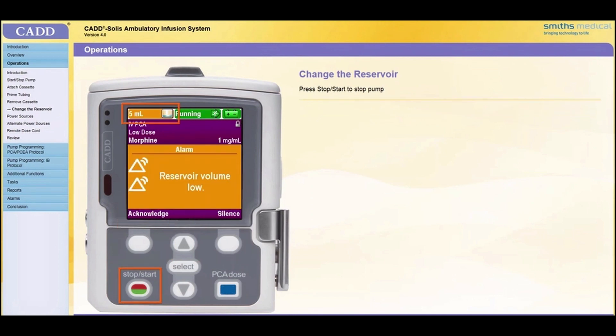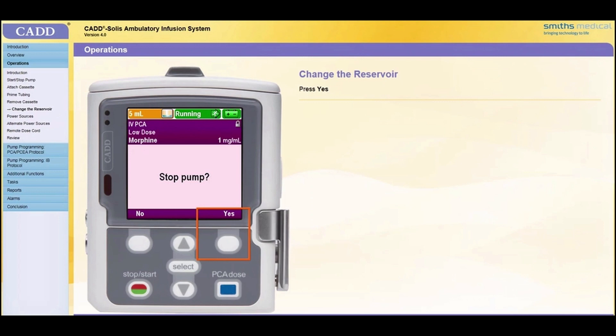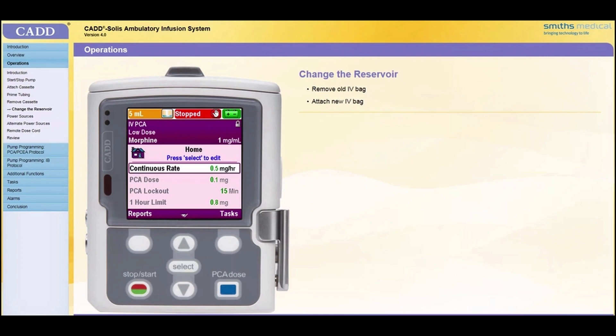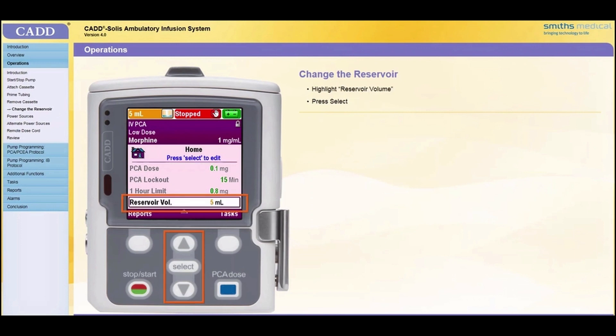If you only need to change the IV bag on the CAD administration set and not the administration set itself, follow these steps. Stop the pump by pressing the Stop Start key. When Stop Pump appears, press Yes. A message appears indicating the pump is stopping. Remove the old IV bag from the tubing and attach a new IV bag. On the Home screen, scroll to highlight Reservoir Volume. Press Select.